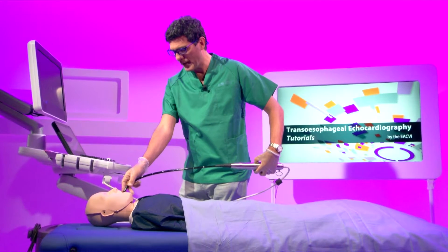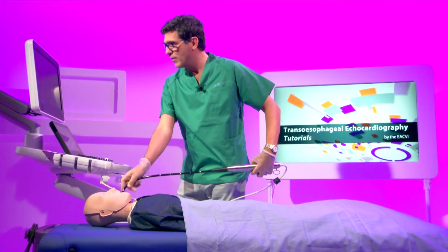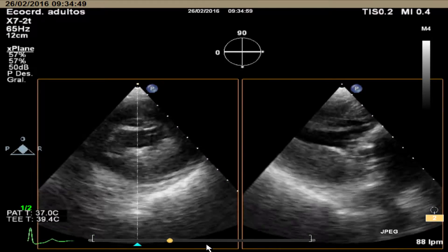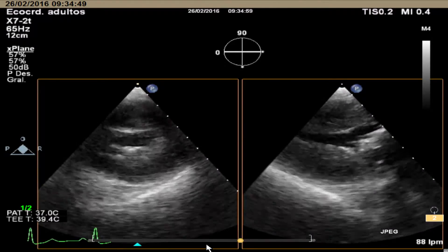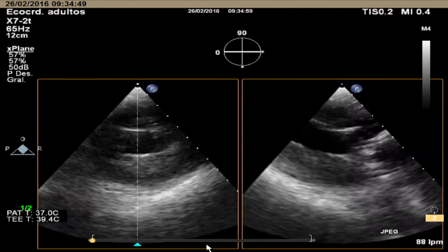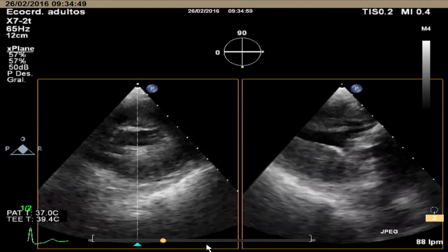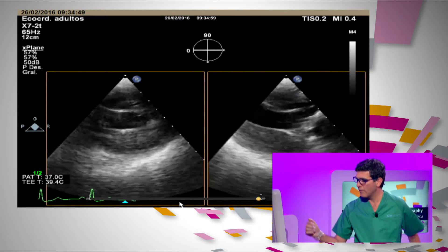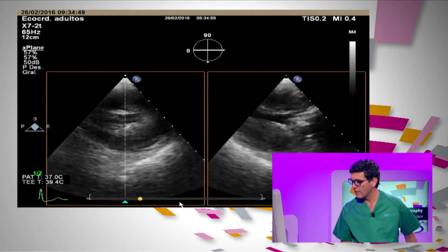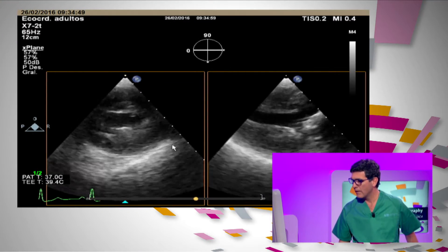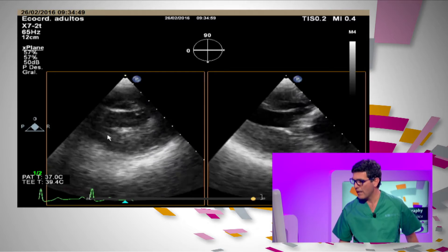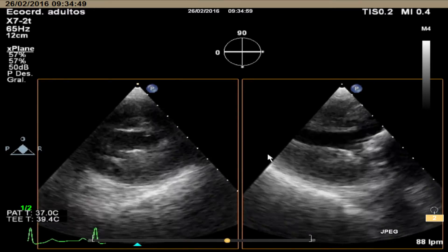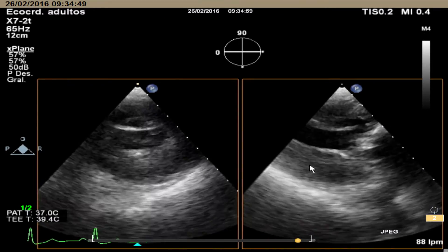Trying to see the left ventricle. Here we can see in a biplane mode with the X-plane, the left ventricle that is heavily hypertrophied — shown here in the short axis and in the long axis.